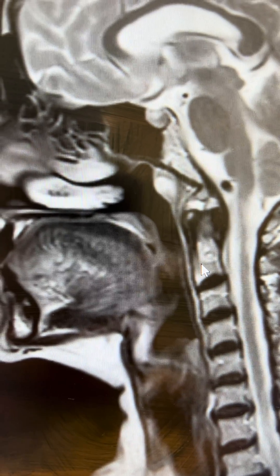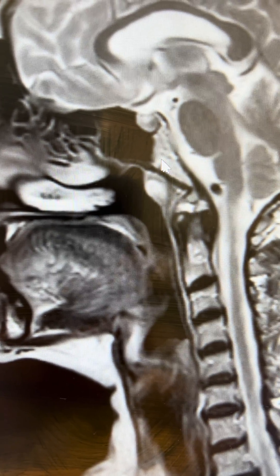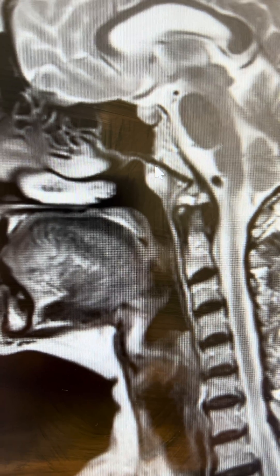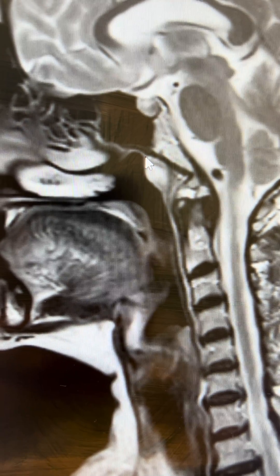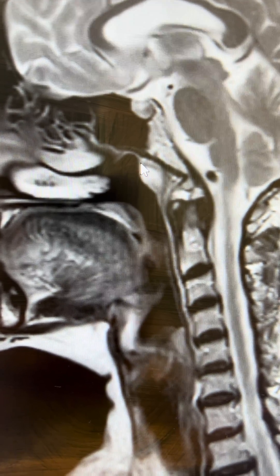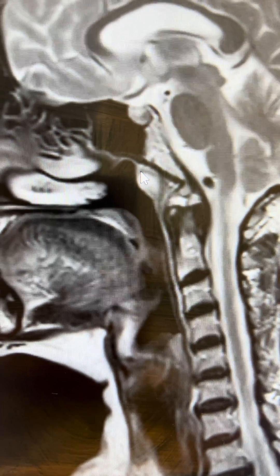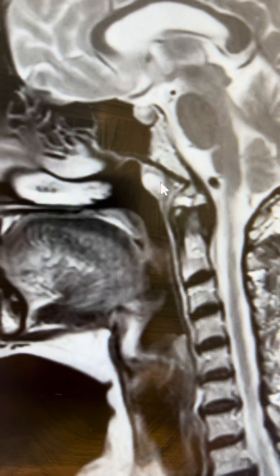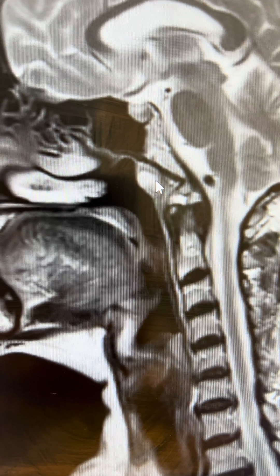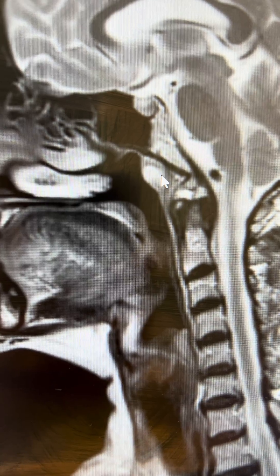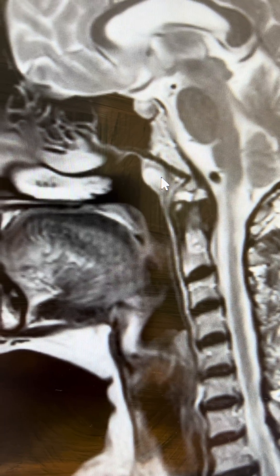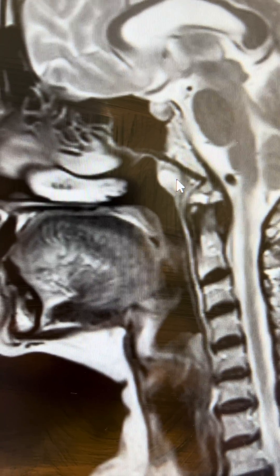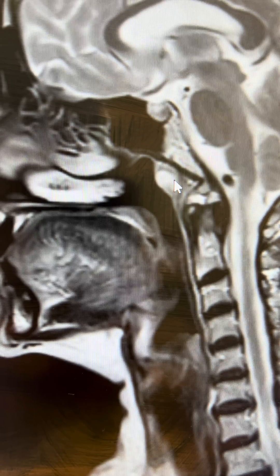What you can see on one of the sections is there is a lesion in the nasopharynx. This is a well-defined cystic lesion seen along the midline of the nasopharynx. It is hyperintense on T2.